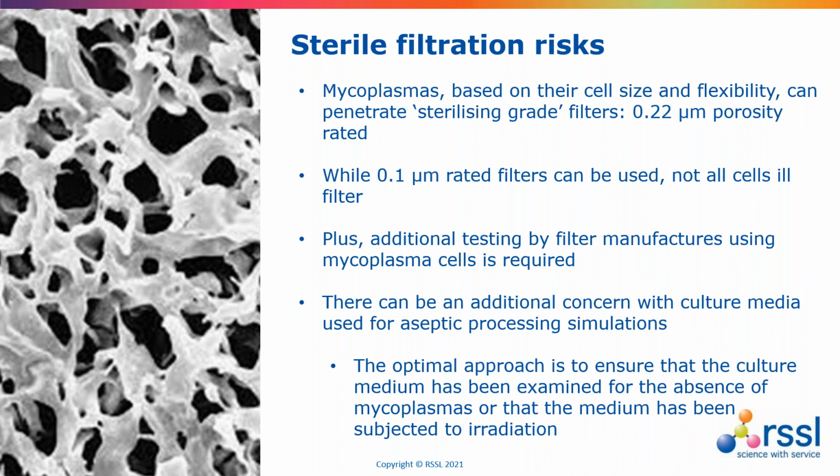We also need to be careful of things like culture media. So culture media used in media simulation trials, for example, this could be tryptone soya broth. Quite a lot of that is contaminated with mycoplasma.